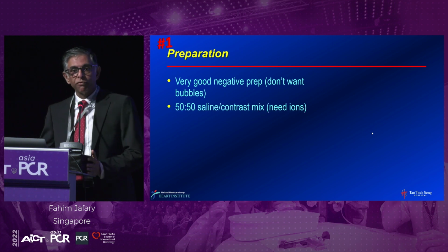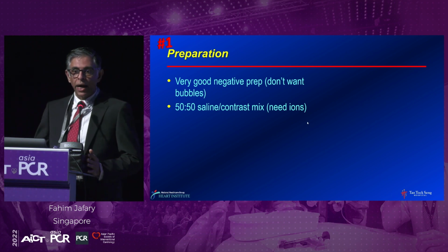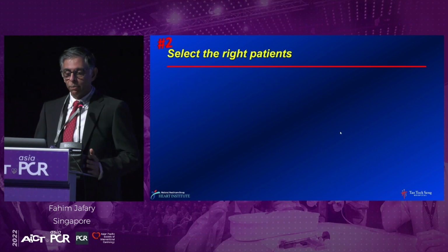And you prep it with a 50-50 saline contrast mixture because you need saline in there. You need ions to conduct the electricity within the balloon.